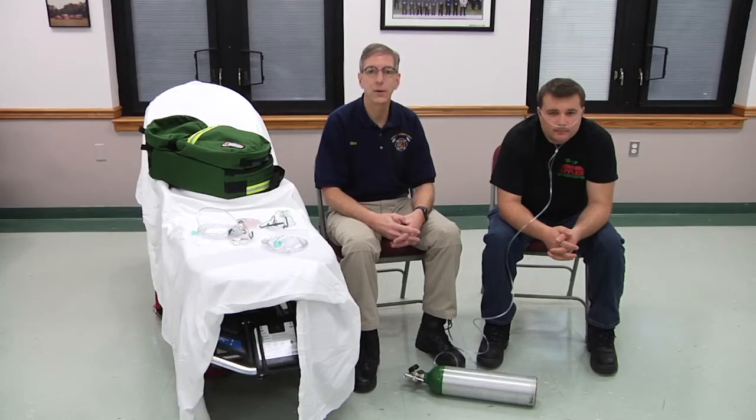Welcome to Fire Engineering Training Minutes. I'm Mike McAvoy. Today I want to talk about tips for using a small volume nebulizer.